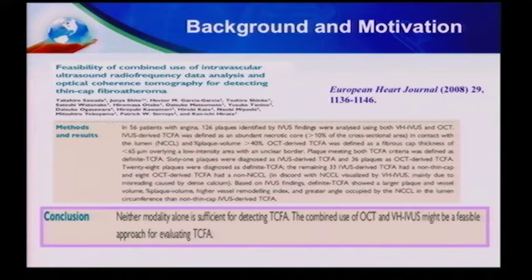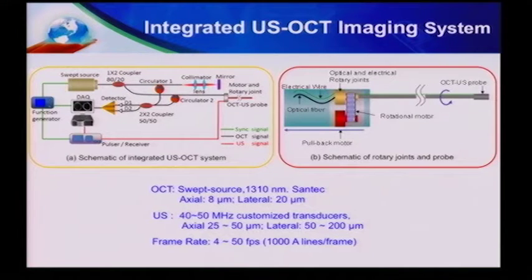The conclusion is that neither modality alone is sufficient to detect TCFA, and the combined use of OCT and IVUS will be a better approach. That motivates us to develop a system that integrates ultrasound with OCT in a single catheter device.